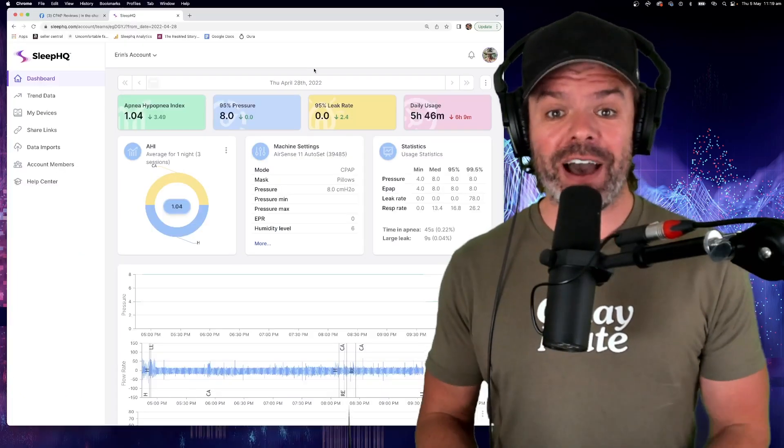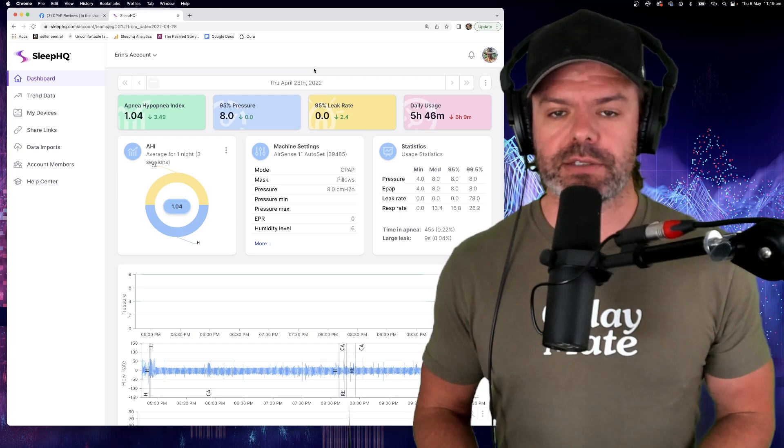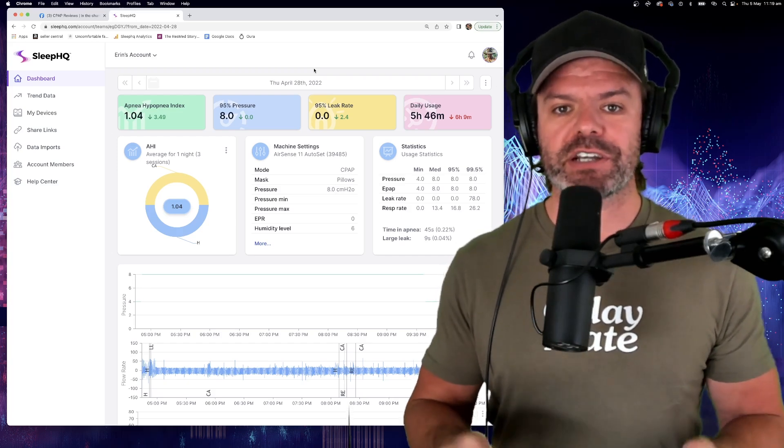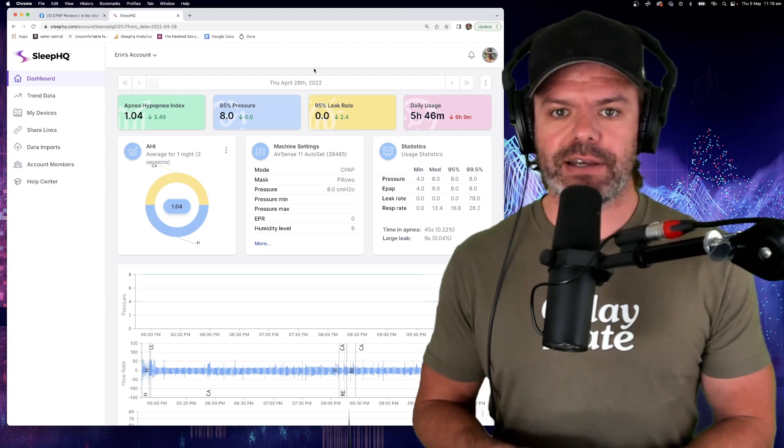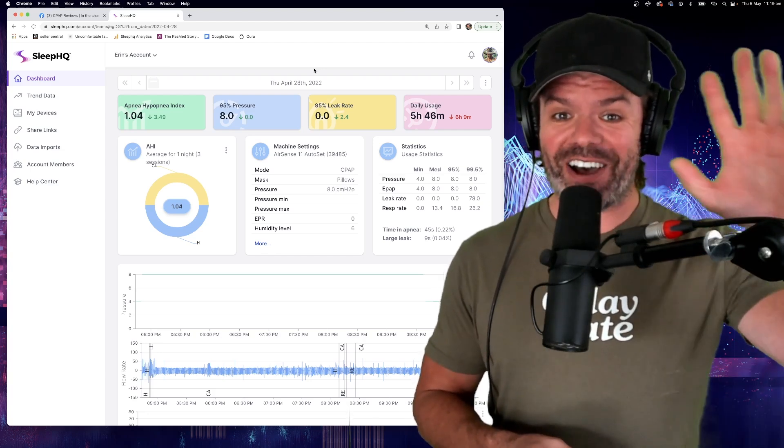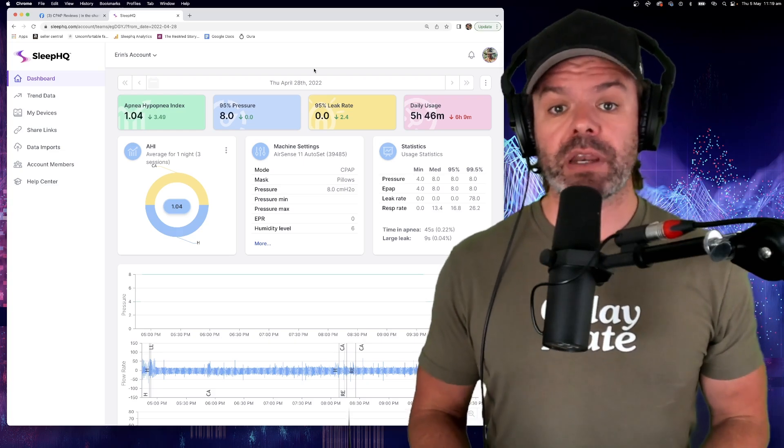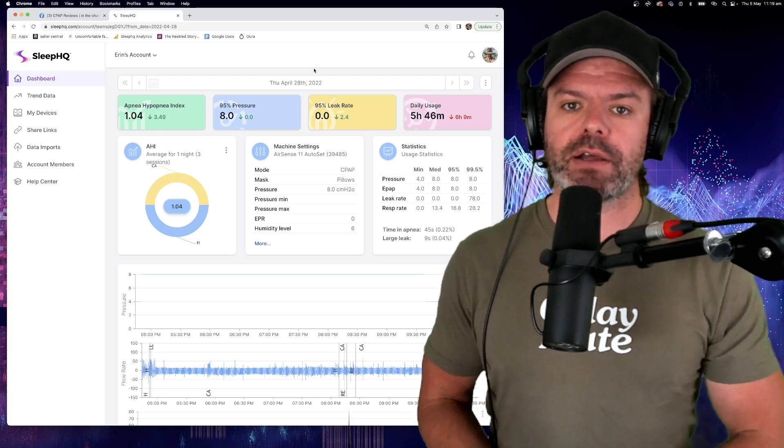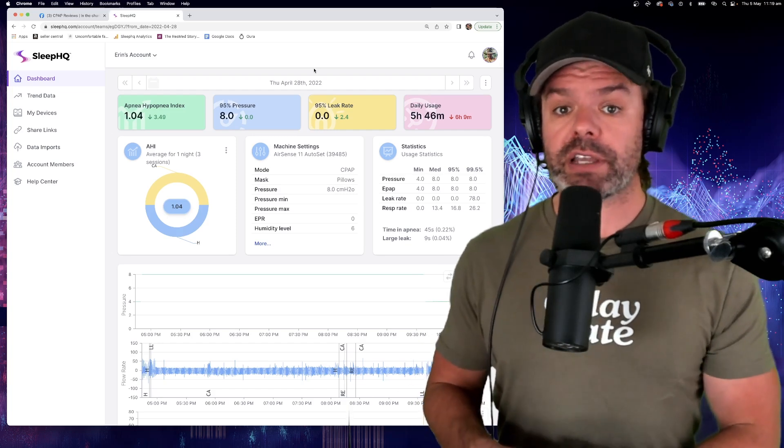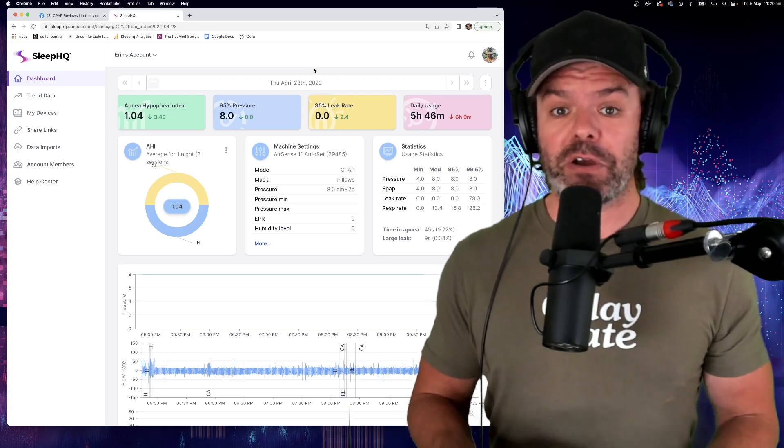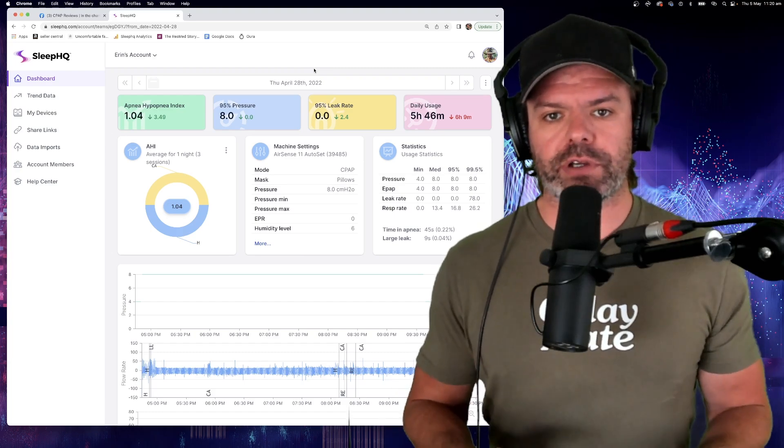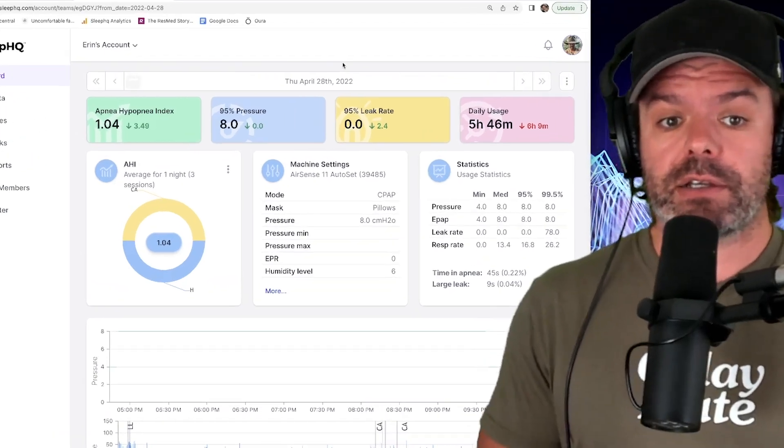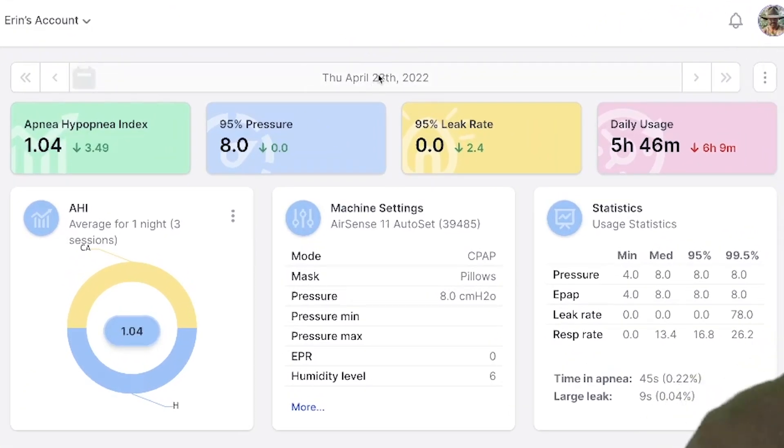So here we are over on the dashboard at Sleep HQ and this is Erin's full detailed, high definition CPAP therapy data. Now, although Erin's all the way over there in Las Vegas, hi Erin, and I'm down here in Melbourne, she sent me an invitation to view her data via email. And once I accept that invitation, I could log into my Sleep HQ account on any device, anywhere, and have a look at Erin's data. So here we are. So you can see currently we're on Thursday, April 28th and her results are really good.